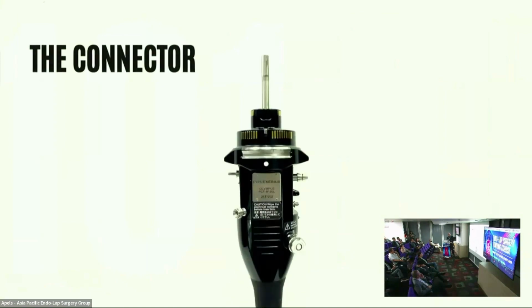Okay, so the connector, if you see the connector, this is the new generation connector. You just attach it to the system. But before, it's separated into one into the camera system and one into the light source system. There's what we call a pigtail connected to it. But this one, everything is connected into one rod. I mean, one series of connection, and it's watertight.